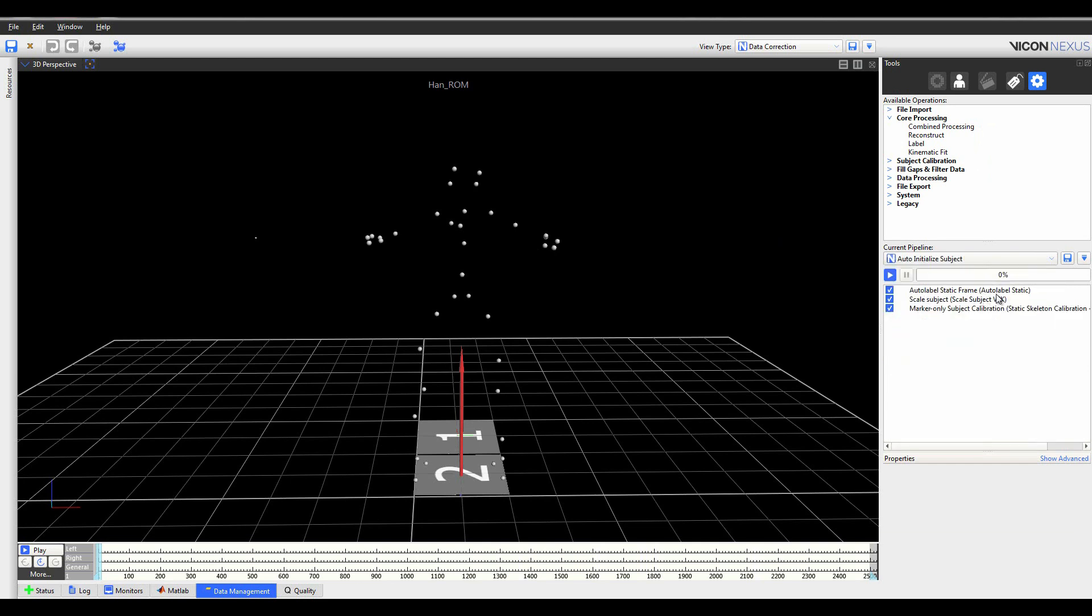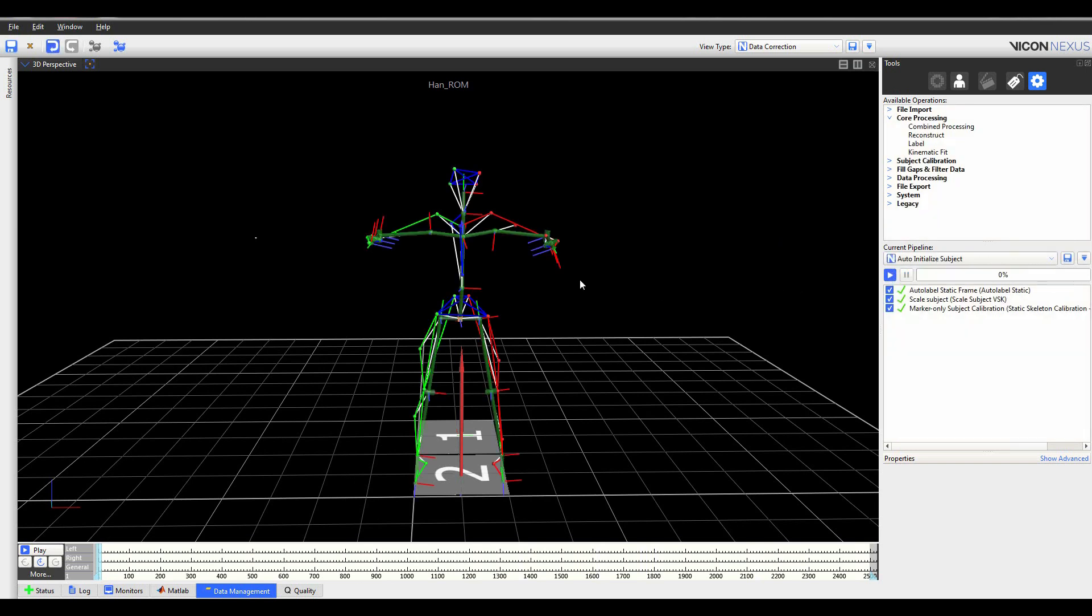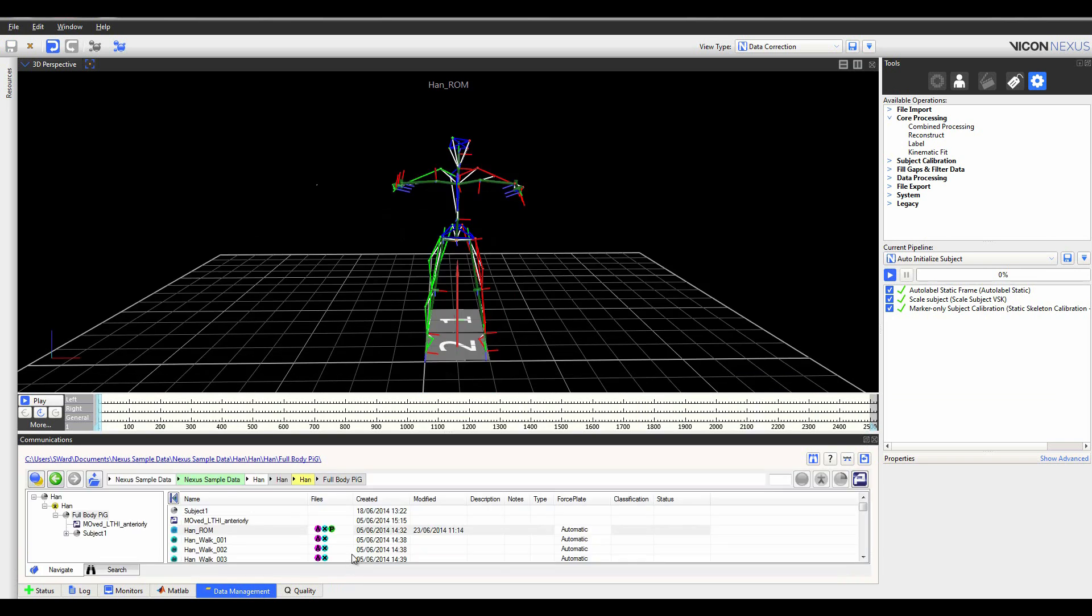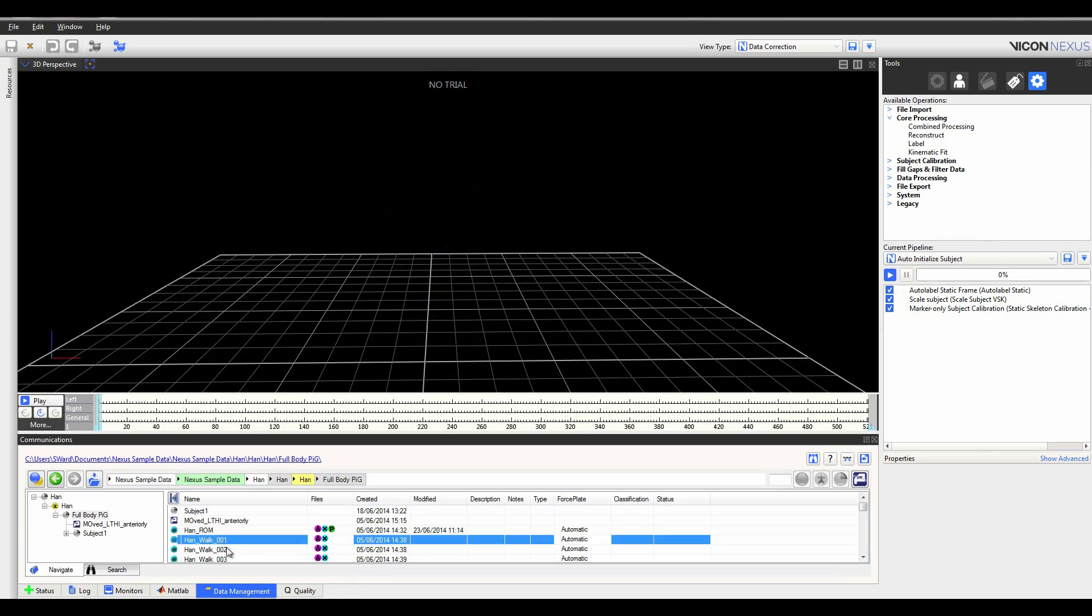The entire data processing engine has been replaced, which provides immediate user benefits while also significantly improving the ability to progress the application in the future. This new engine has allowed Vicon to build some powerful new features into Nexus 2.